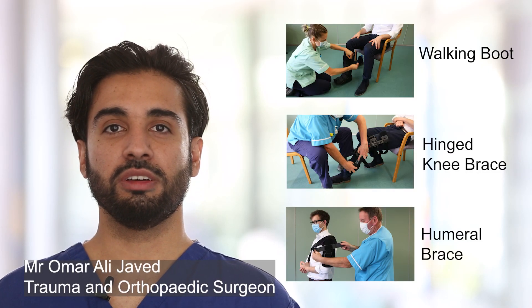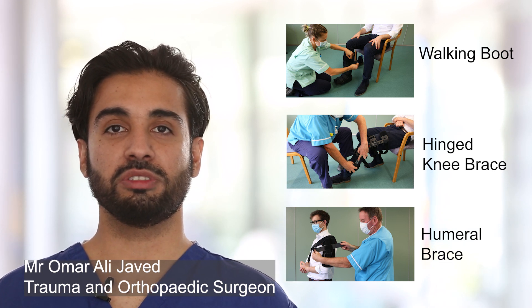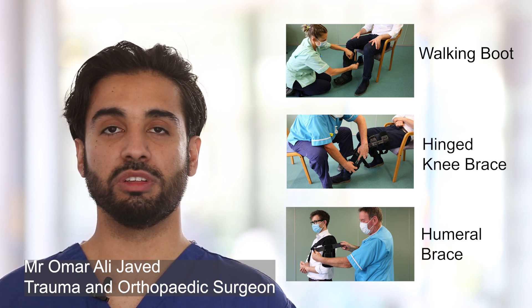This is a short video with information on various boots and braces. There are lots of different boots and braces that can be applied for various injuries. We will show some of the common ones in this video.